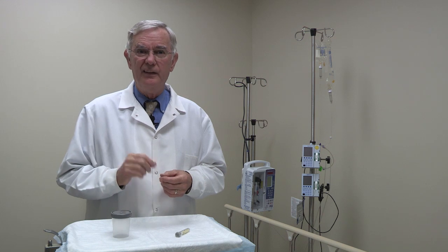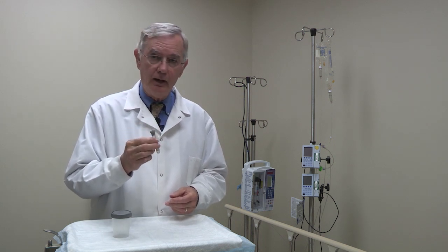Also remember that urine is a really good culture medium, so all specimens not sent to the lab within 30 minutes of collection should be held in the refrigerator. There are some facilities, however, that ship their specimens to another laboratory, and they may use a boric acid container for that specimen, which may or may not need to be refrigerated.